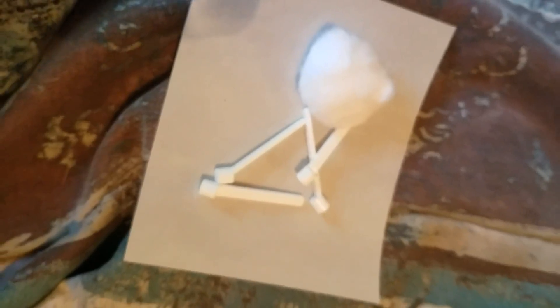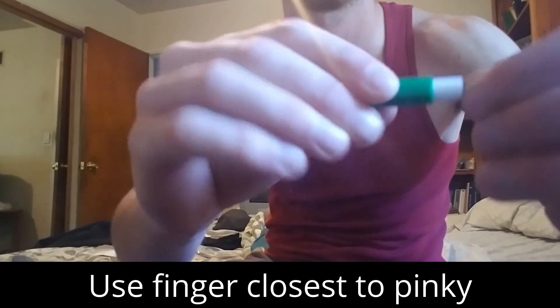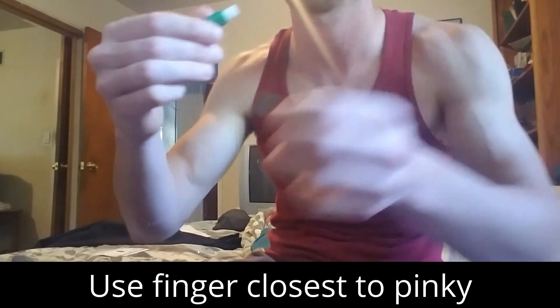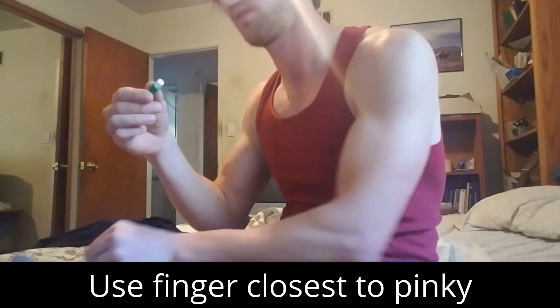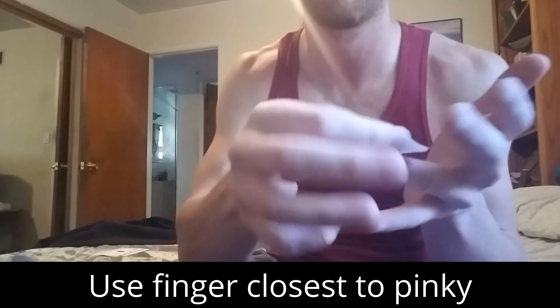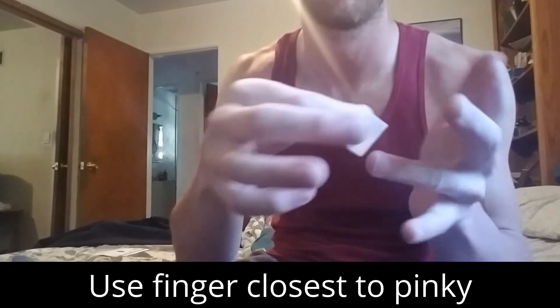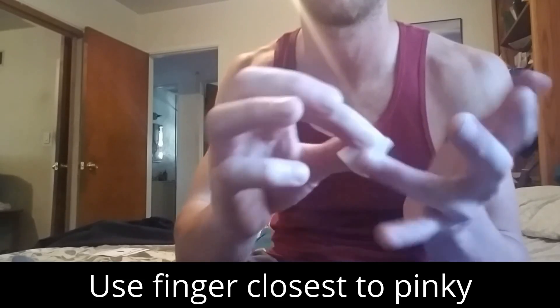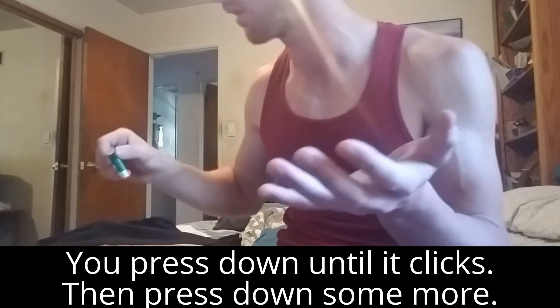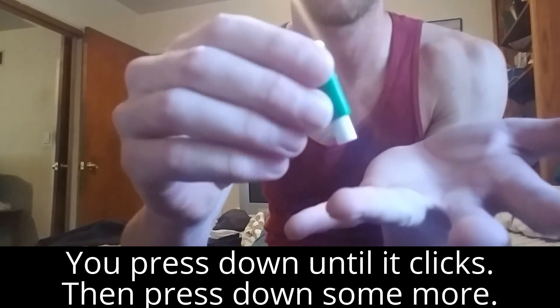Now I've got the four Eldon sticks out, my alcohol swab, and I'm going to get the lancet out. Gently turn it. Now I'm going to rub my finger, make sure it's nice and clean.